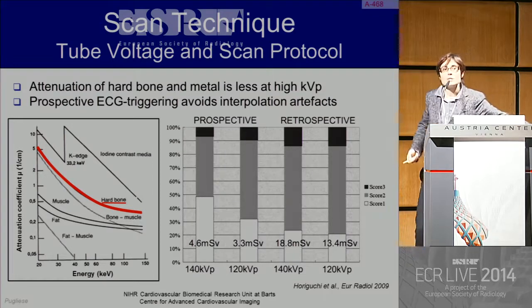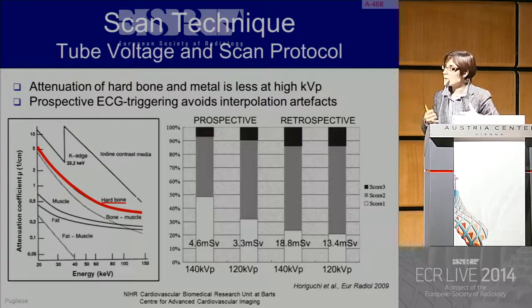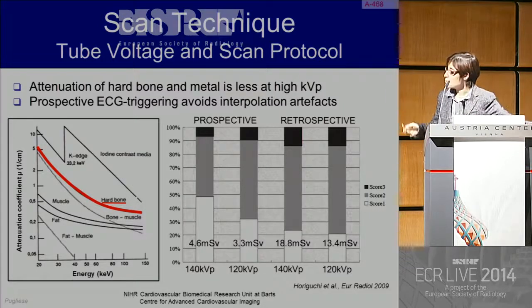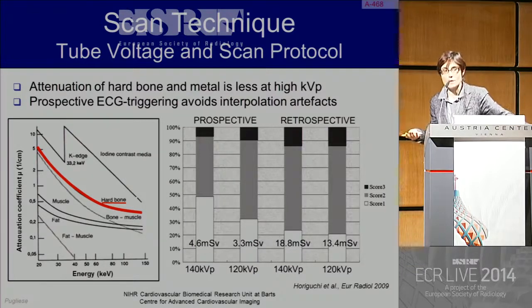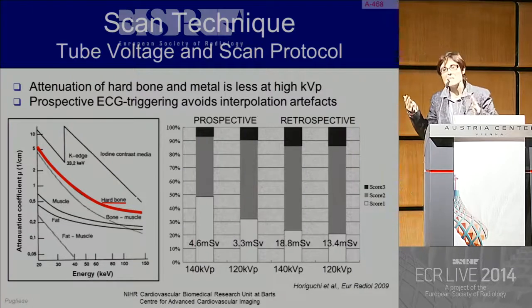So clearly, in order to minimize that halo that we see around a dense calcification, for instance, that we called the blooming effect, we could simply increase the energy of the X-ray photons we are using, hence increase the kilovoltage. Although in principle we don't want to do that to minimize radiation dose to patient, but it may be necessary to do it.